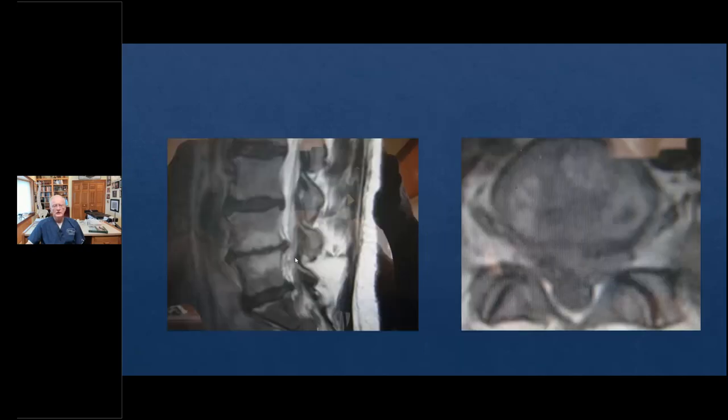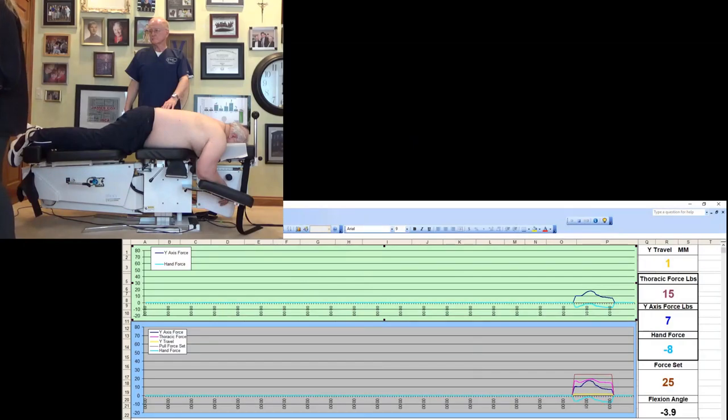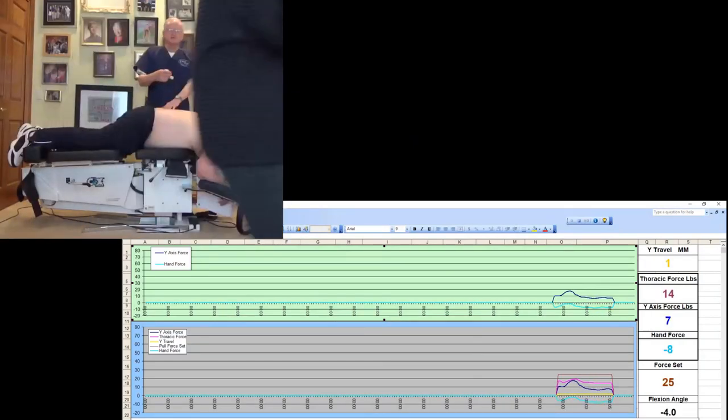So we will move and we will treat this condition. I'm going to do it with a contact on the L4 spinous. I'm going to share with you how we suggest you approach this from a force application from two to eight pounds per segment. Let's go to the instrument now and put this knowledge into our hands. And there you go, Dr. Cox.